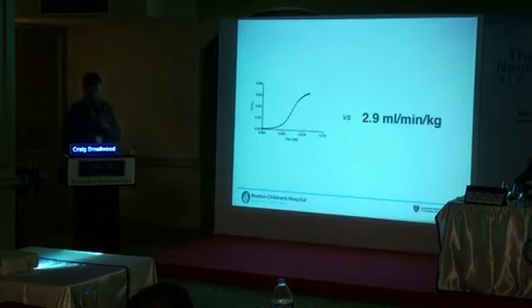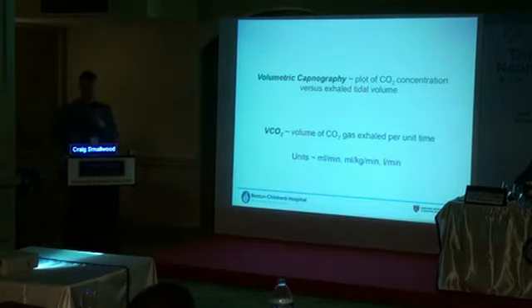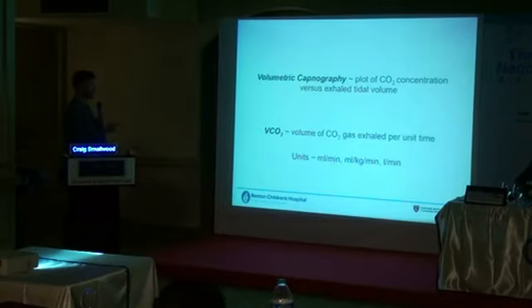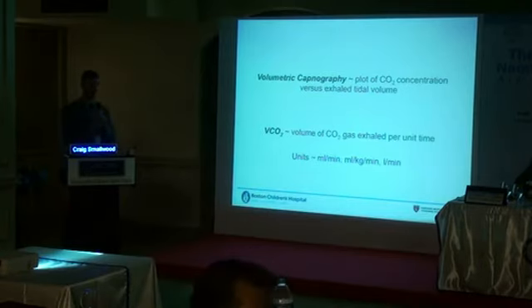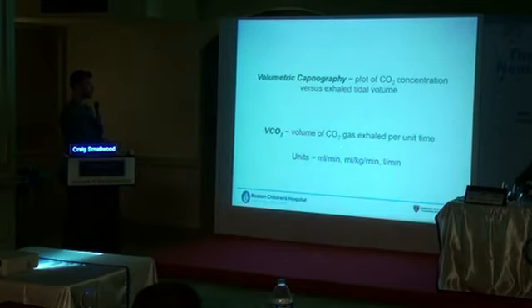So a couple of things on volumetric capnography, and then we'll close our time together. Volumetric capnography is a plot of CO2 concentration. Rania asked about how you calculate these things on the ventilator, but it's a plot of CO2 concentration versus exhaled tidal volume, unlike capnography, which is CO2 and time. So VCO2 is the volume of CO2 that's coming out of our patient per unit time. These are the units we can talk about. I'm always gravitating towards mLs per kilo per minute, but you can also look at mLs per minute and liters per minute.